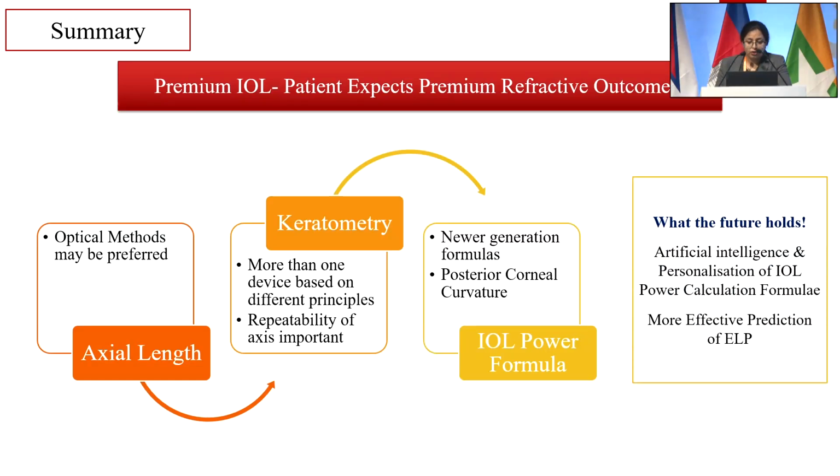What the future holds is artificial intelligence, personalization of IOL power calculation formulae, more effective prediction of ELP.